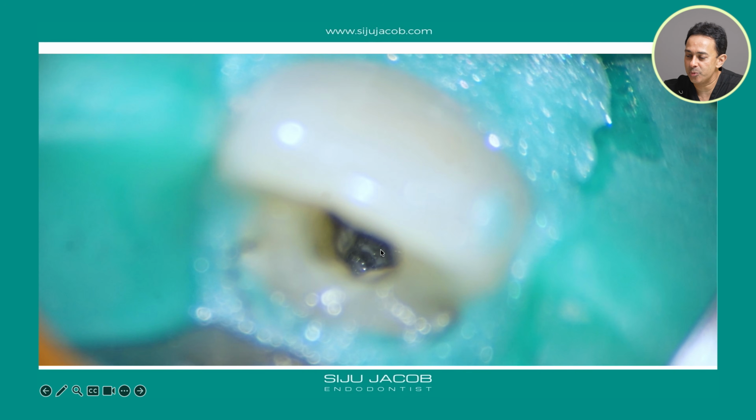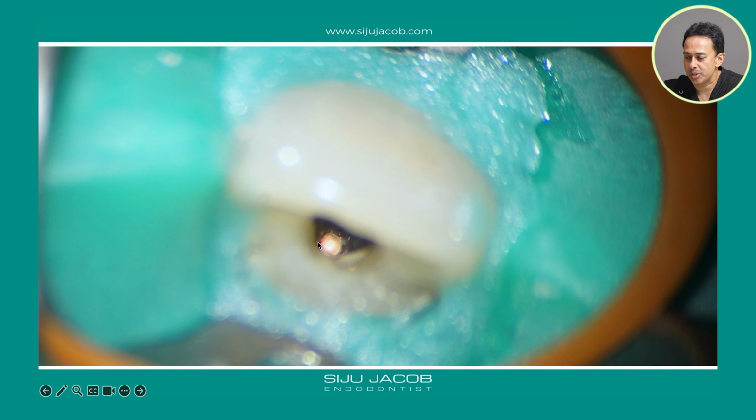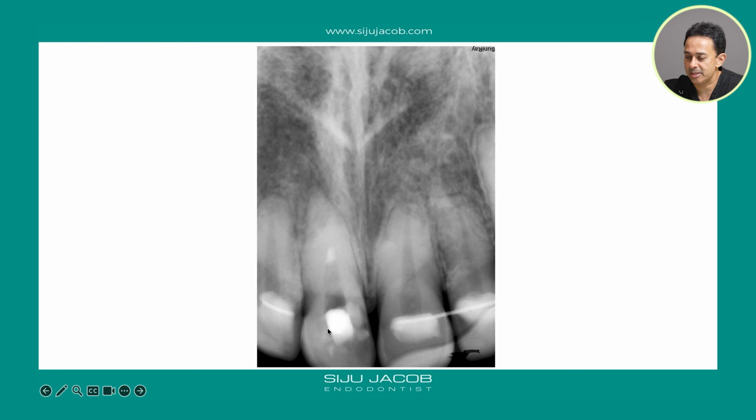So I reached this stage where I wasn't really sure whether or not I should continue drilling down that area. So what I did at that stage was I put a little bit of gutta percha there and then I decided to pack this access cavity with a temporary restoration. So that's the gutta percha as a marker there. And then I closed the access cavity with a temporary restoration and I exposed an inter-appointment cone beam CT.